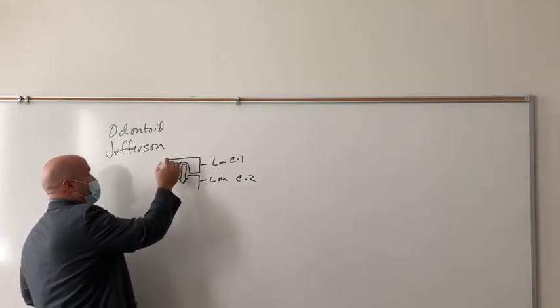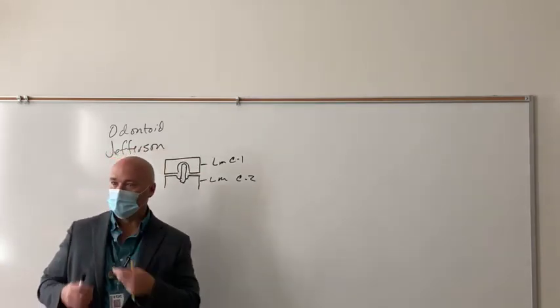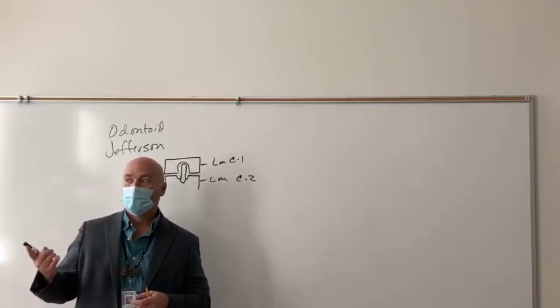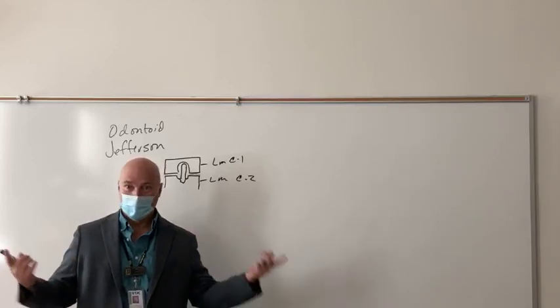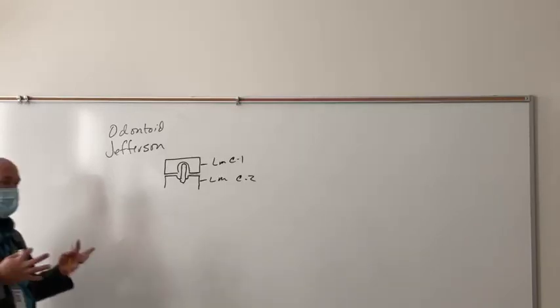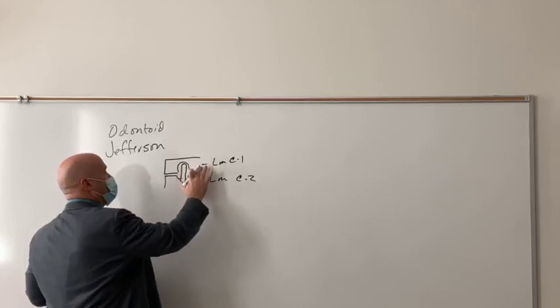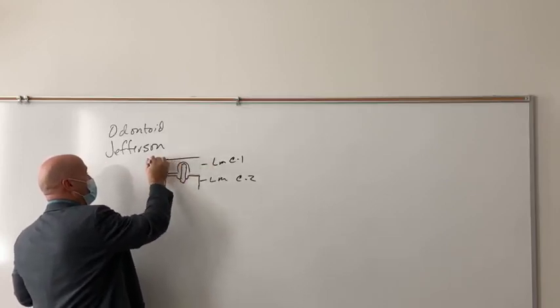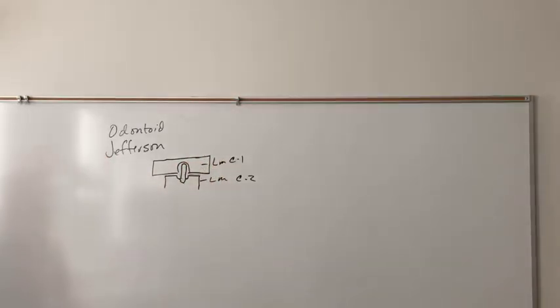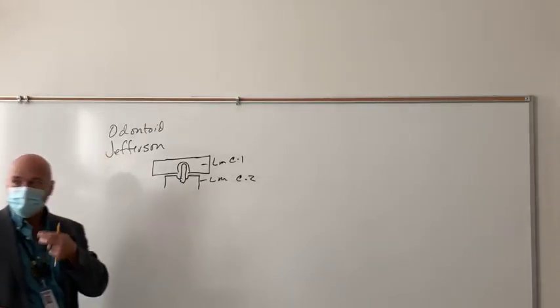So you get a fracture of C1, it's a ring-type bone. So what did we learn in the pelvis about ring-type bones? If you have a break in one place, what are we going to have? A break in another place, right. So a Jefferson fracture involves a fracture of the ring of C1. What's going to happen in a lot of cases is that the lateral masses don't line up, but rather the lateral mass of C1 is out past the lateral masses of C2. Okay, so these are the two fractures that we're going to see on open mouth odontoid.